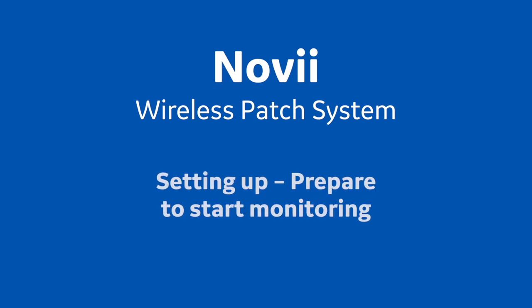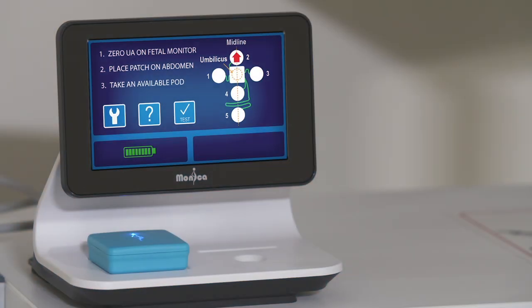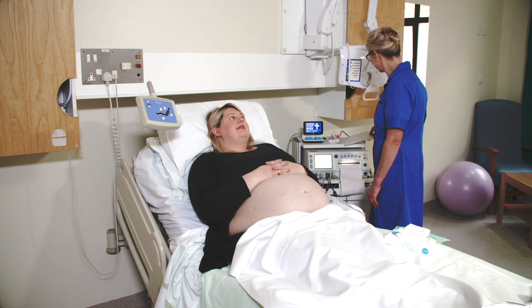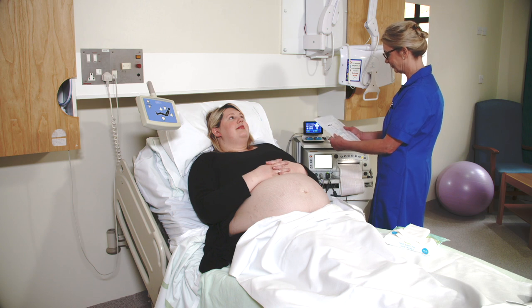Training Session 3: Preparing to Start Monitoring. This is the start screen. To begin monitoring, just follow the 1, 2, 3 instructions on the Novi screen. Instruction 1: Press the UA reference button on the monitor. Instruction 2: Place the patch. When you are ready, take the foil pouch and check the expiration date on the front label and confirm that it has not been opened or damaged.